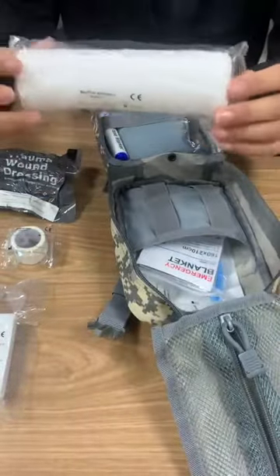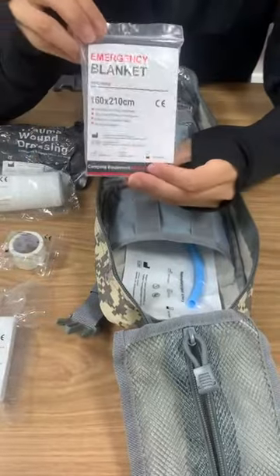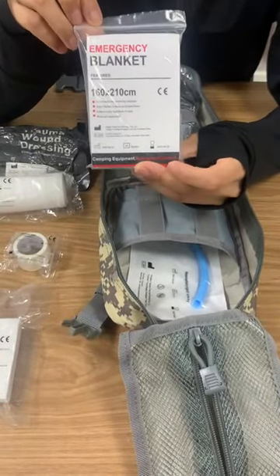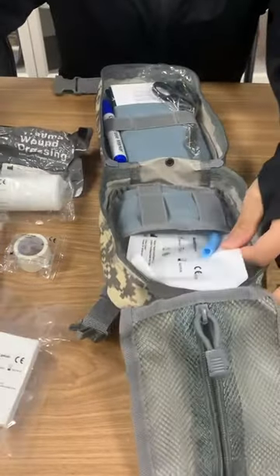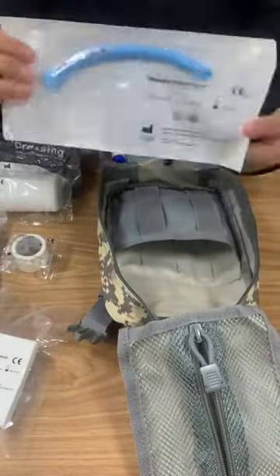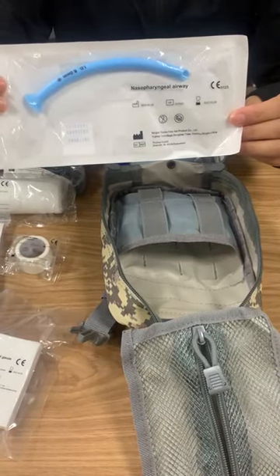And one PBT bandage. And one emergency blanket — the color is silver. And this is a nasopharyngeal airway.